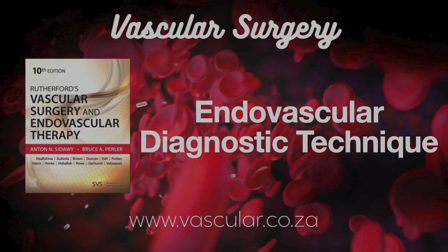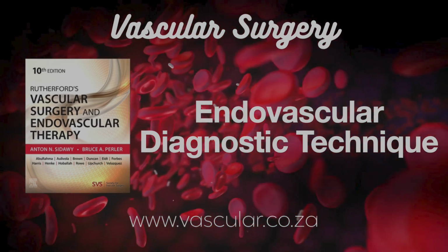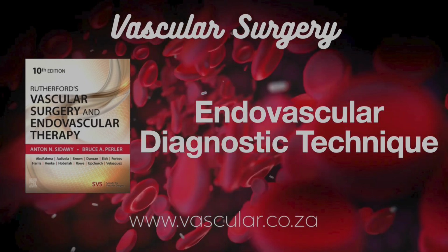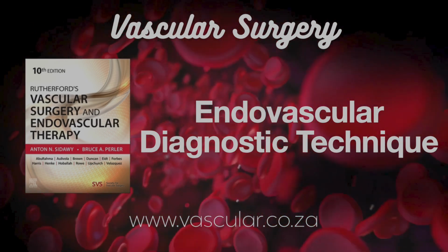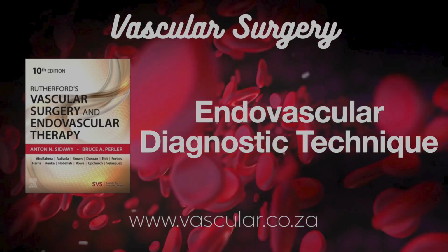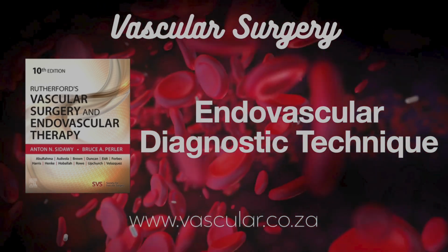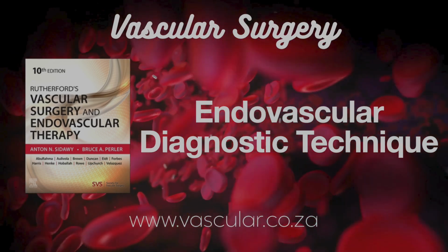What about the popliteal vein behind the knee? Usually needs the patient lying face down, prone. Yeah. Interestingly, there are often two popliteal veins running with the artery. And you need ultrasound. Essential, really, especially if you're doing it for DVT diagnosis or treatment, because the vein itself might be clotted. Ultrasound lets you see the puncture and wire passage, even if you don't get blood return.